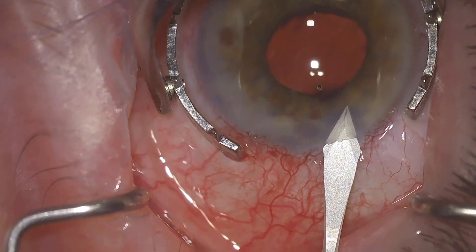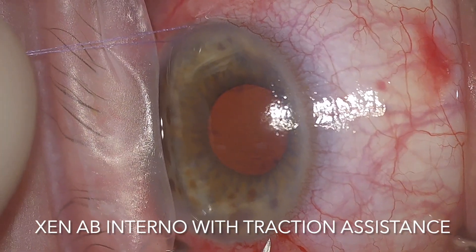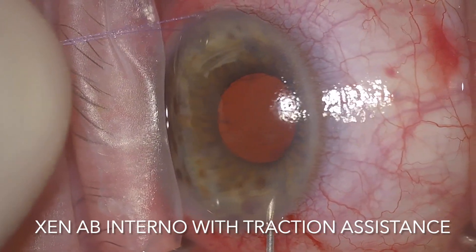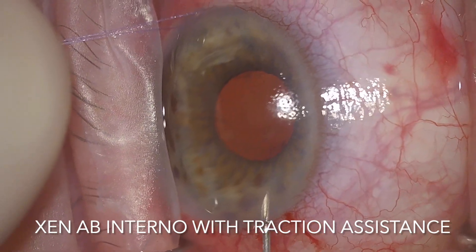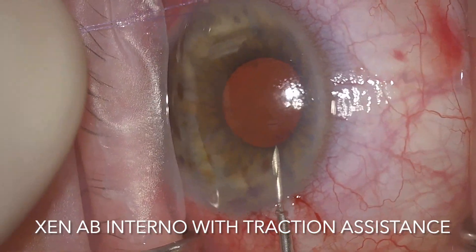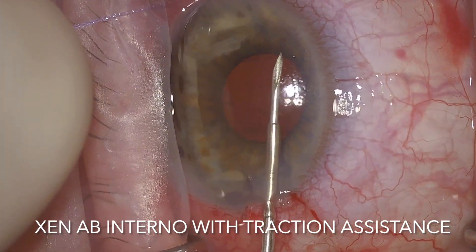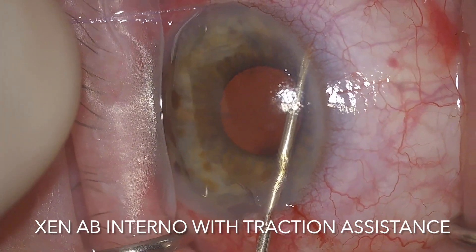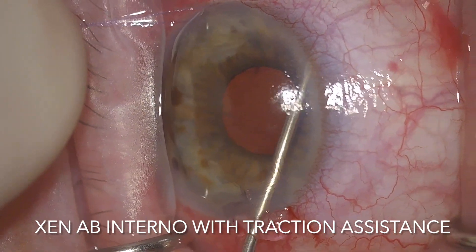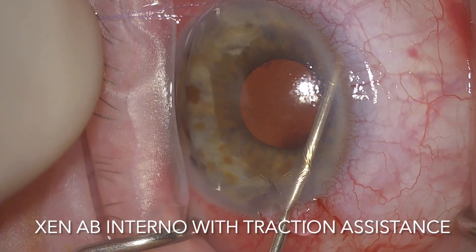Here I'm making a 1.8 millimeter metal keratome blade temporal incision, angulated towards the 12 o'clock position to help facilitate placing the Xen through this temporal incision. Here you can tell the eye is on traction. I am placing my finger on the traction suture to help more inferiorly redirect the globe and get access to that 12 o'clock position.